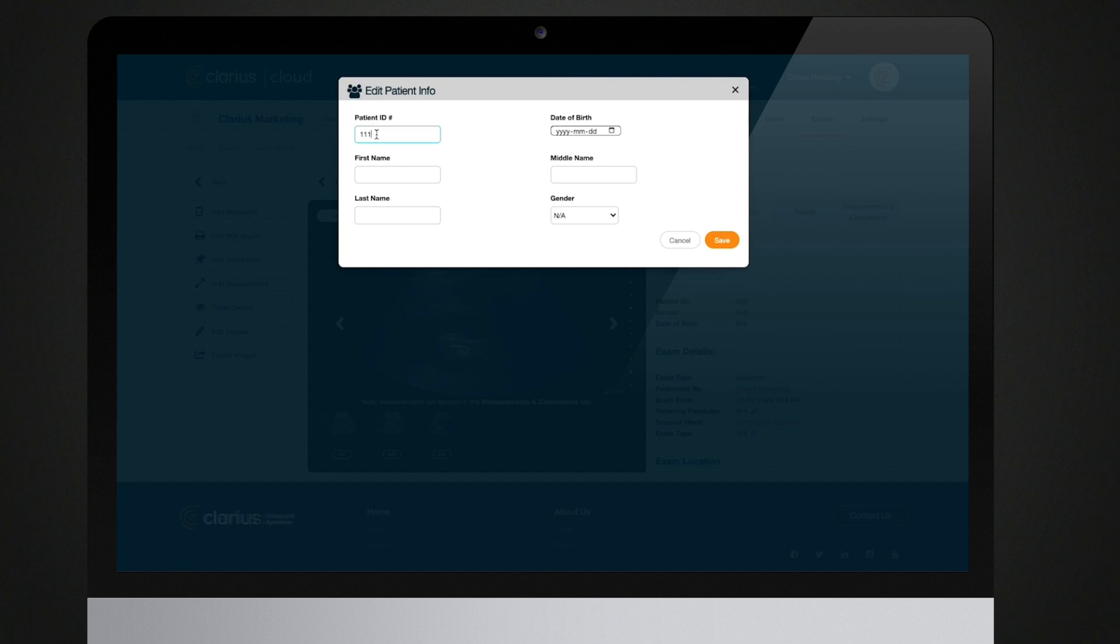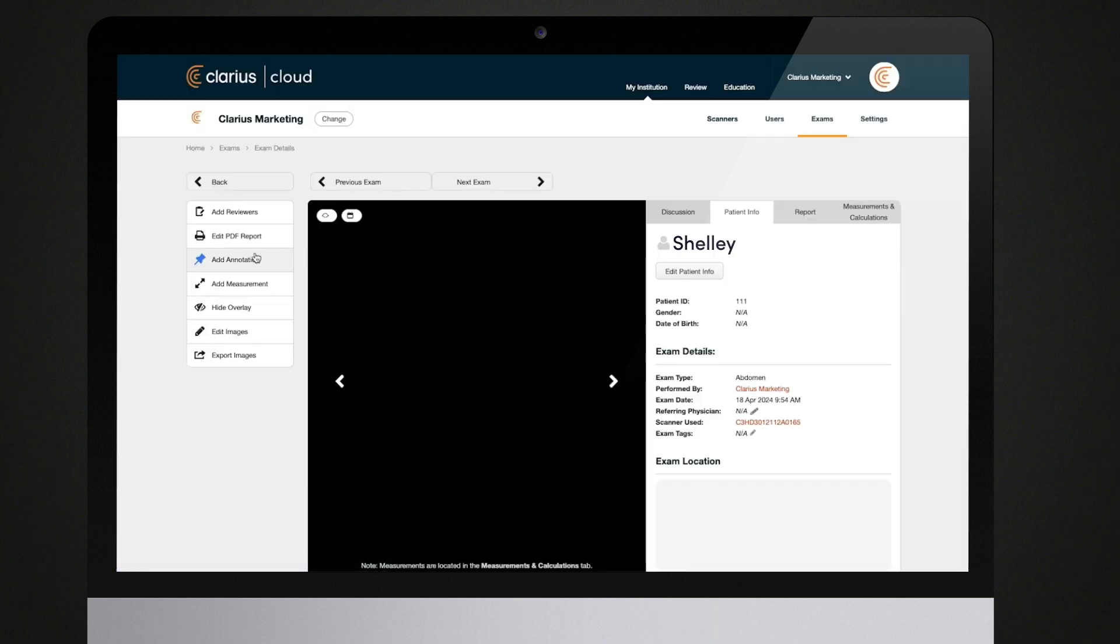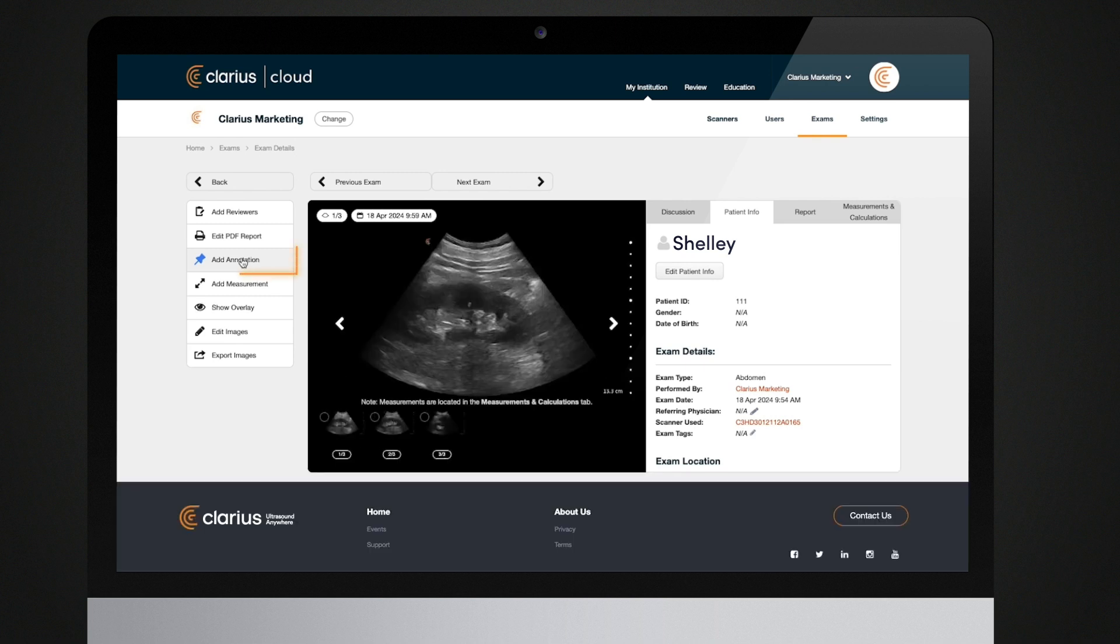Once the exam is associated with a patient, you can edit the patient information by clicking Edit Patient Info. Keep in mind that this will save the patient record across all exams that reference this patient.